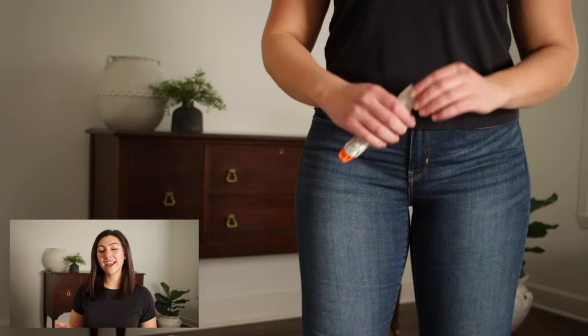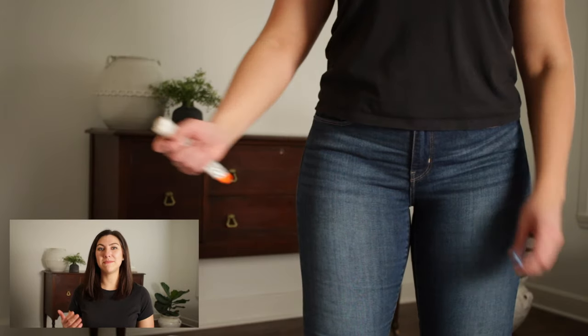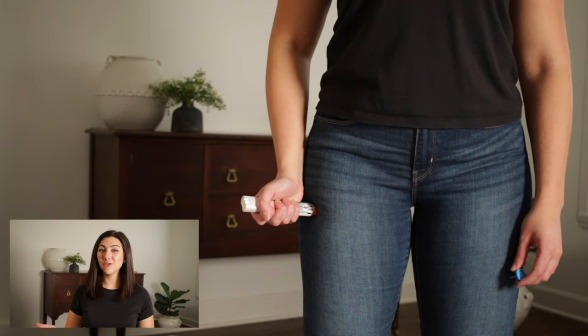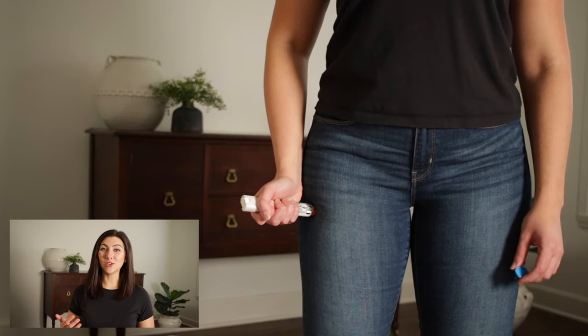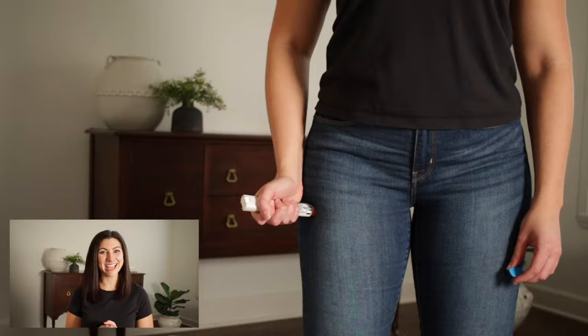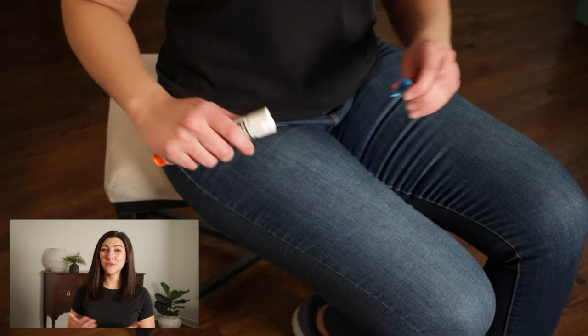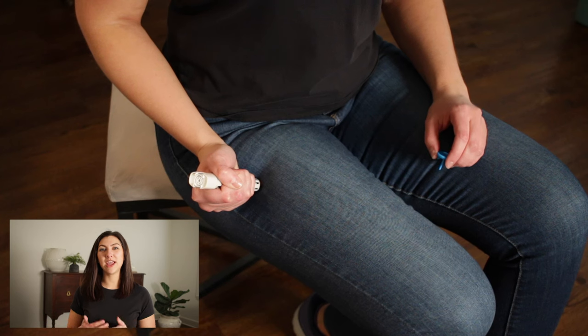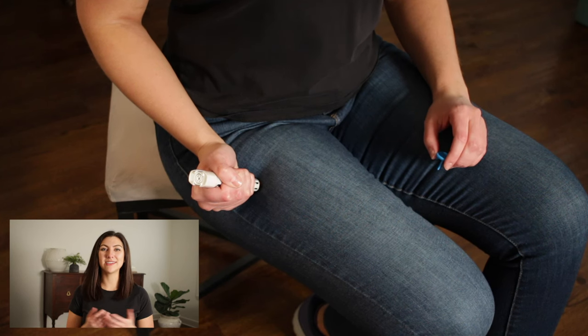You can see here that I am demonstrating both ways of administering an EpiPen. The first is the swinging motion on myself, being sure to hold the EpiPen in place for 10 seconds. The second is demonstrating how you would administer an EpiPen on someone else.